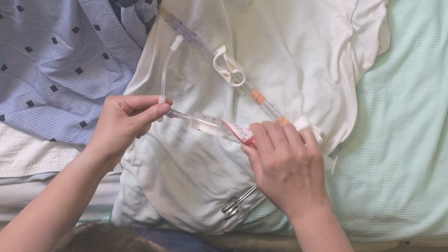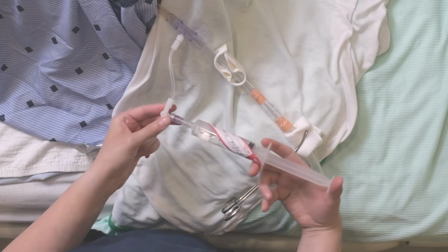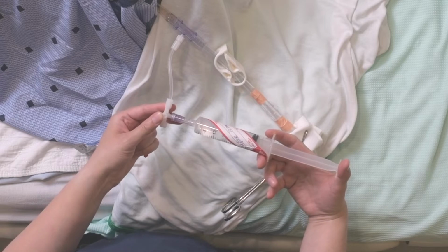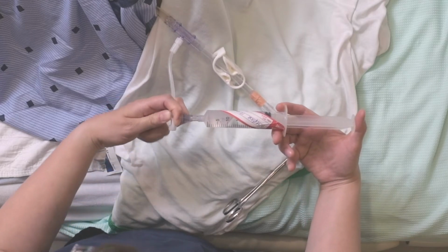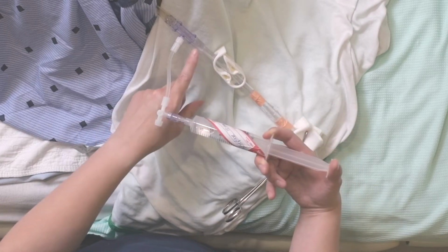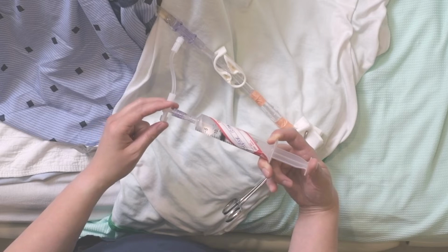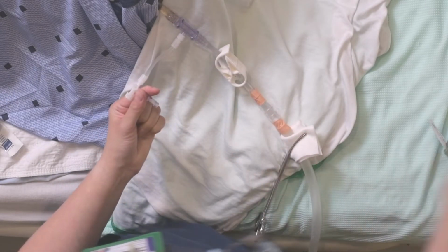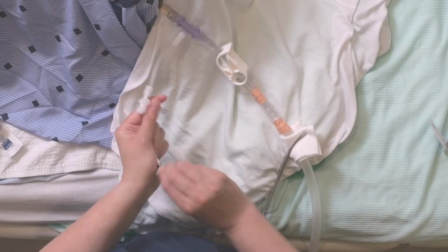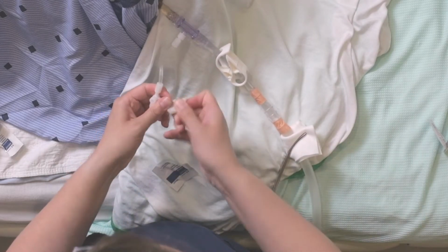Attach the syringe containing the alteplase to the needle-free connector. Turn the valve of the 3-way connector so the off is towards the capped end, allowing the drug to go into the patient. Inject the alteplase. Remove the empty syringe. Clean the needle-free connector again for 15 seconds with an alcohol swab and let it dry.